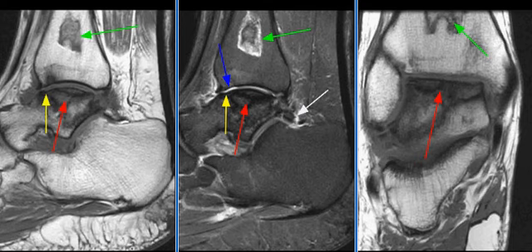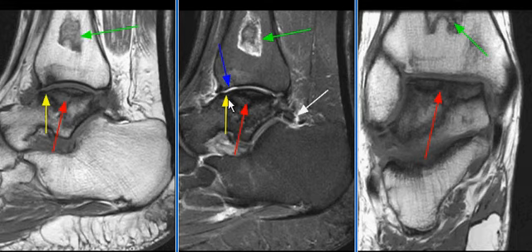A 50-year-old taking steroids for bone marrow transplant complained of ankle pain. MRI examination shows sclerosis of the talar dome with a serpentine hypo-intense and variably hyper-intense border, consistent with avascular necrosis.